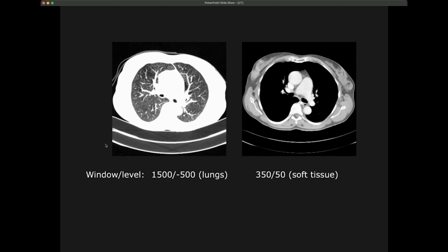This is the bed of the scanner where the patient lies, and on top of that is a kind of mattress to keep the patient comfortable. And this is just a cover, some kind of clothes, or mostly they ask the patient to wear a gown when they go into the scanner. So you see already that depending on what we want to look at, we might have to use some processing which is relevant for what we want to look at.